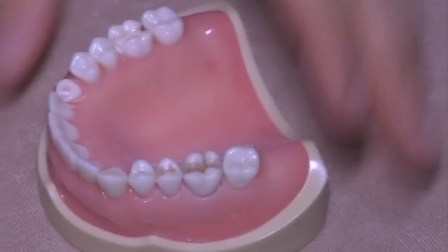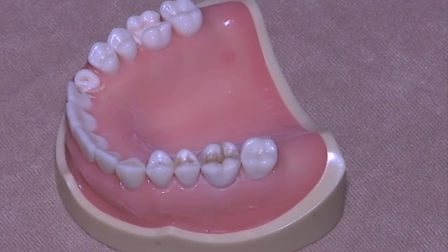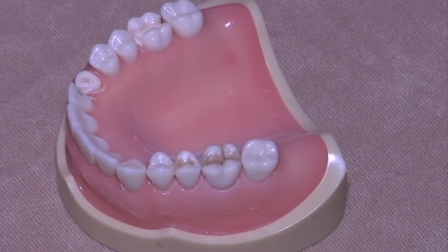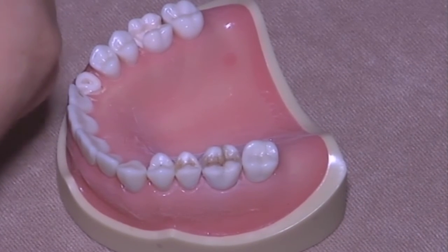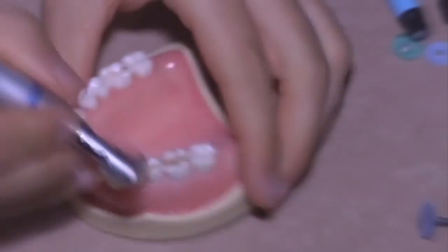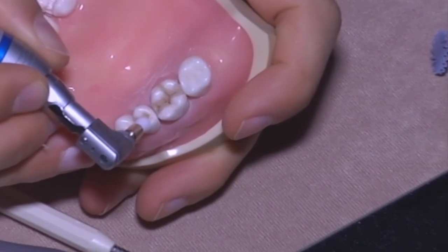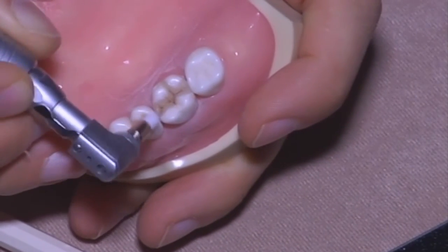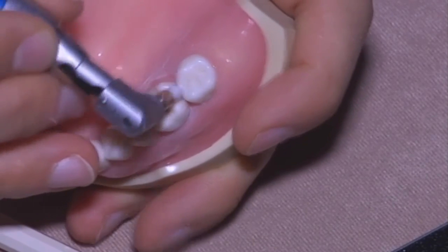Now these are okay, and thus we can move to the brush, which is mandatory, of course, for having a polishing effect. Remember that while you are doing that, you should blow air on the teeth.